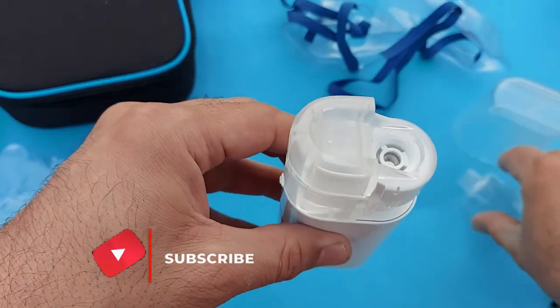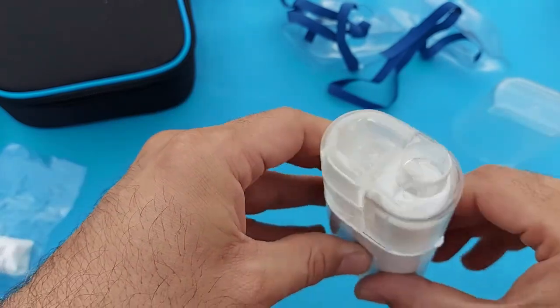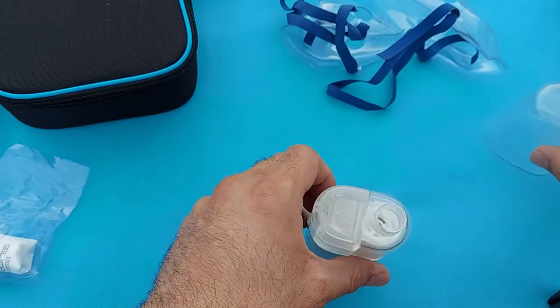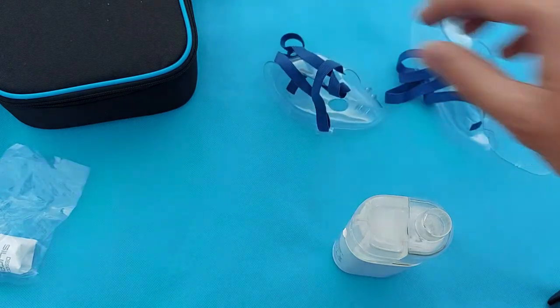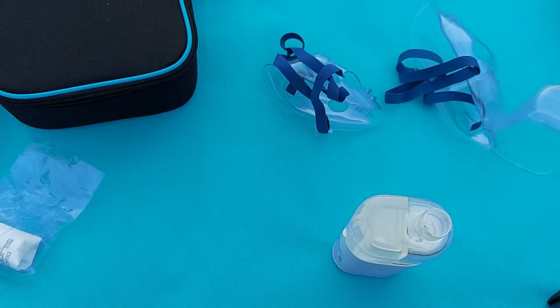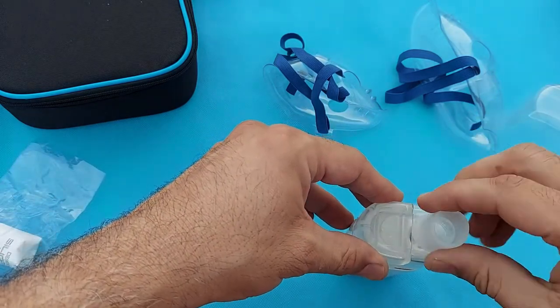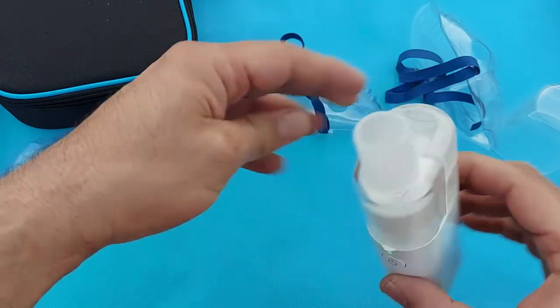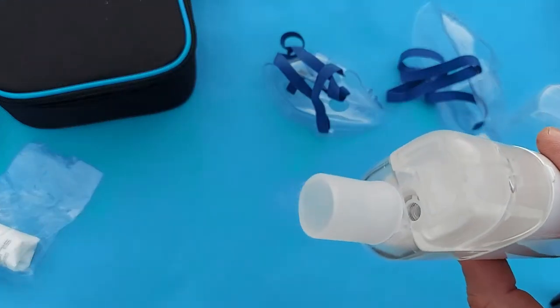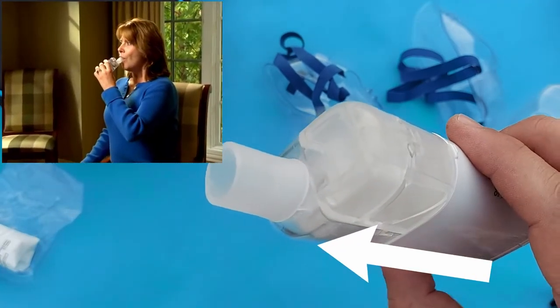Now put this part back. If you want to use the mouthpiece for inhalation, you can put the mouthpiece here. Take the mouthpiece and install it like this. Now press the power button and you can see the steam is coming out. Put it in the mouth as shown in the video for steam inhalation.